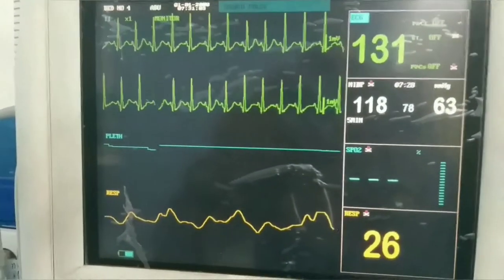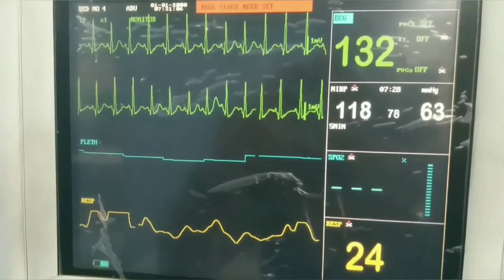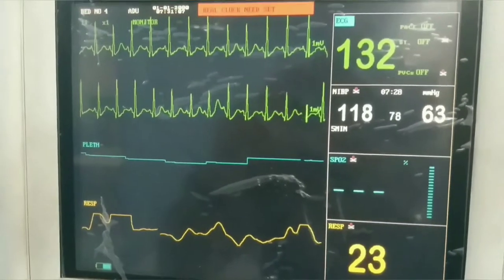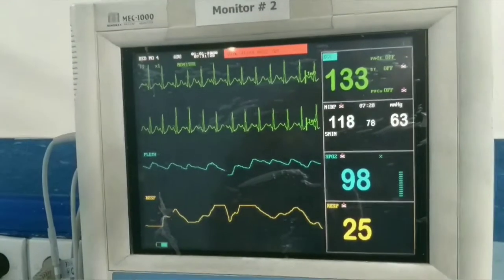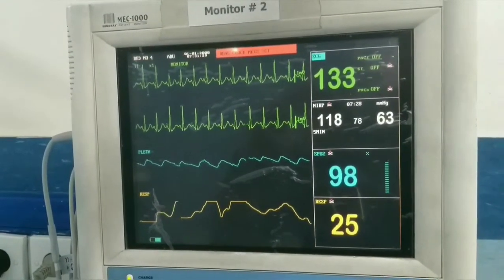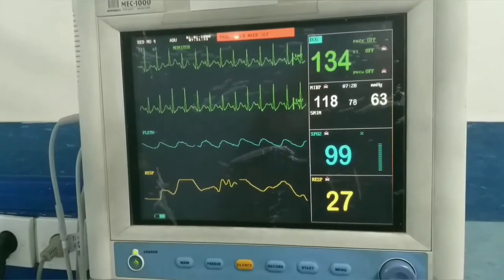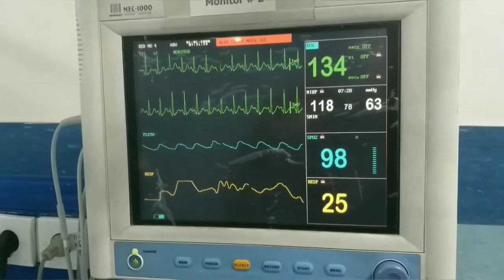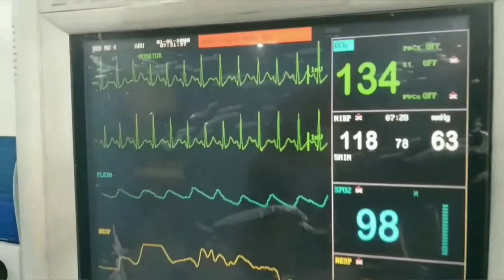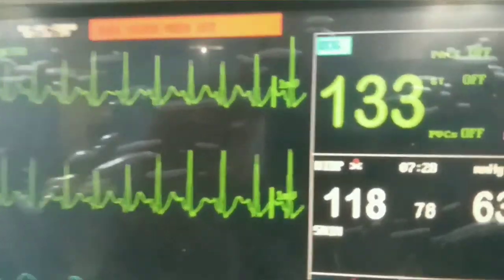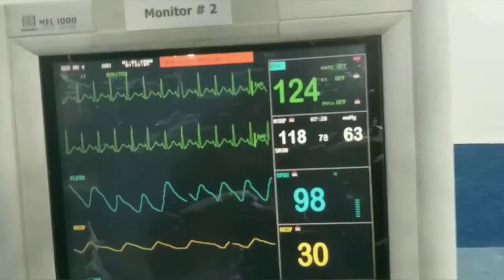In this video we are going to talk about the use of the cardiac monitor in the ICU setting and ER. Cardiac monitors are used to continuously monitor the heart rate, which is 134 here. There is a display of the continuous rhythm lead where you can see a P wave present and R-to-R regular.